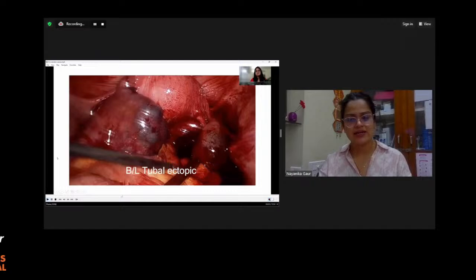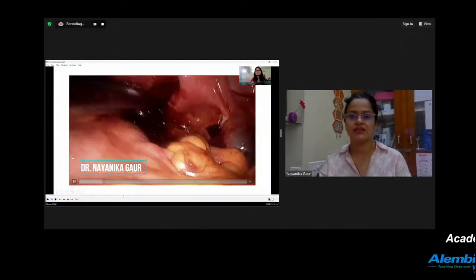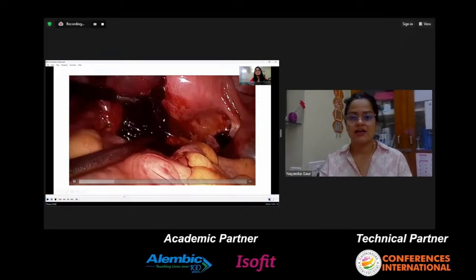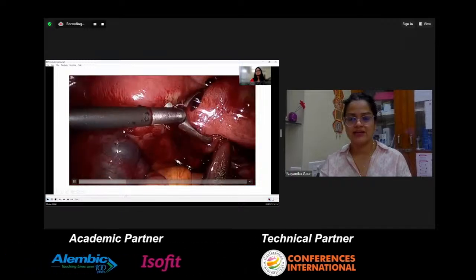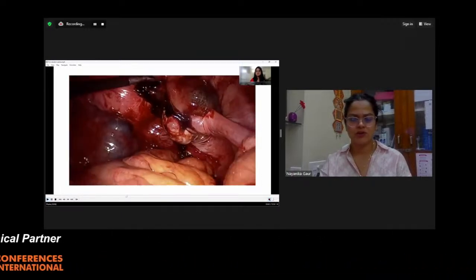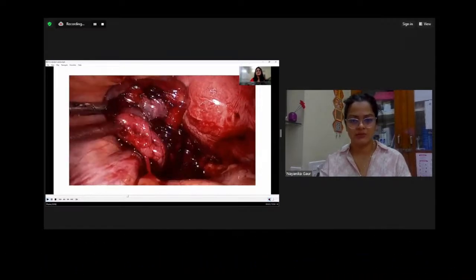On the right side there was a tubal rupture, and on the left side there was an impending rupture, and we could see large blood clots on both sides. As we tried to assess the anatomy and remove all the clots, we were able to identify the rest of the anatomy of the pelvis.